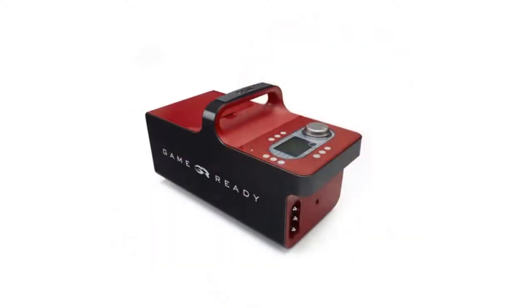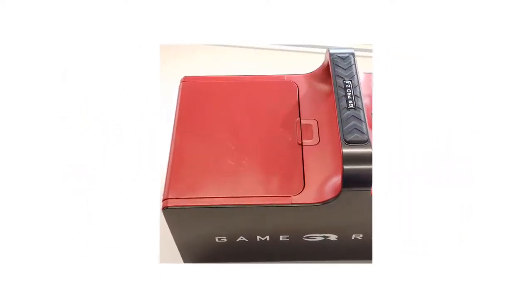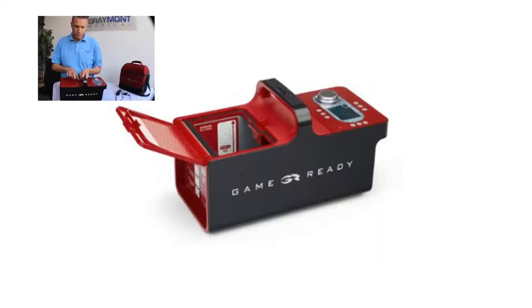Take the unit and open the lid — press that button right underneath the handle and the lid should swing open.